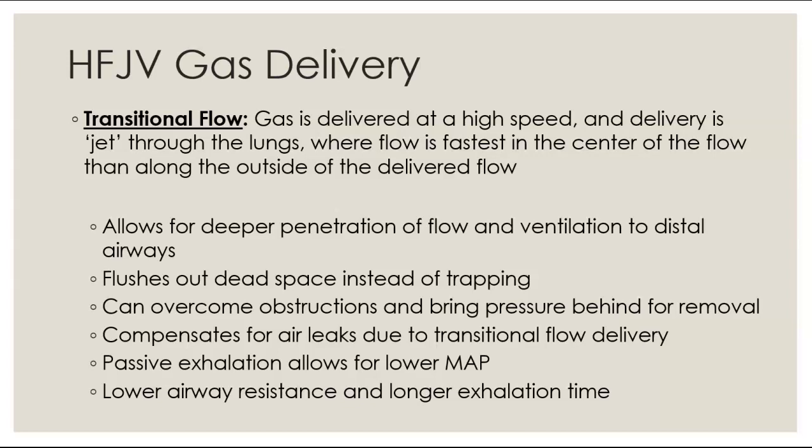Because of this passive exhalation, we can tolerate lower mean airway pressures, which we don't set a mean airway pressure, but we do set a PEEP, which allows those airways to be open and recruited.